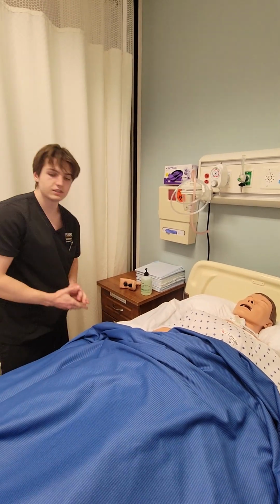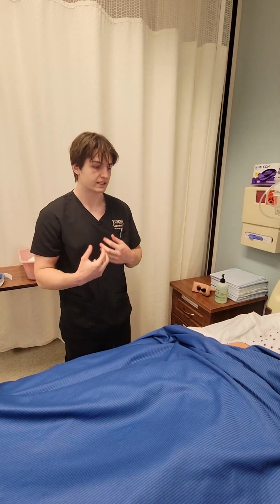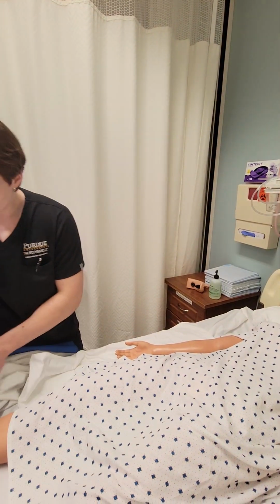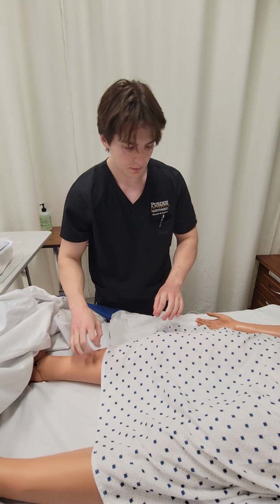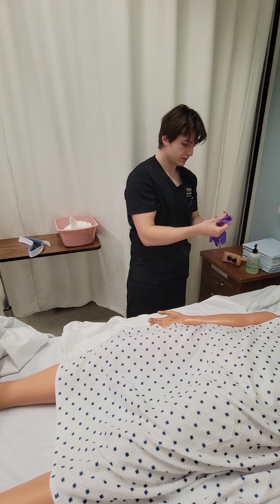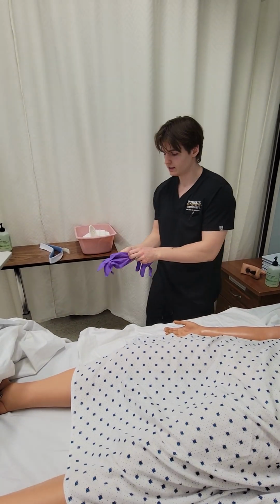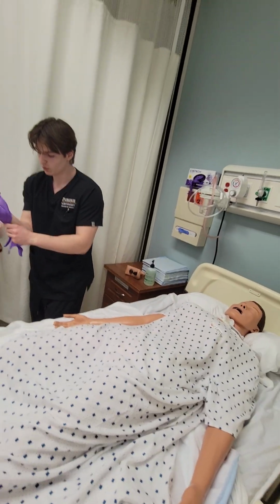Alright, so this procedure is going to start with pericare. So for this I am going to need to expose your private parts, so if you feel uncomfortable at any point during this procedure, feel free to let me know. But I'm going to put on some gloves first. And so on my care set right here, it is filled with warm water and some soap.